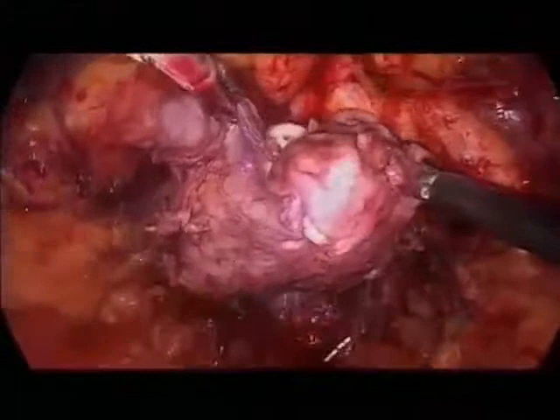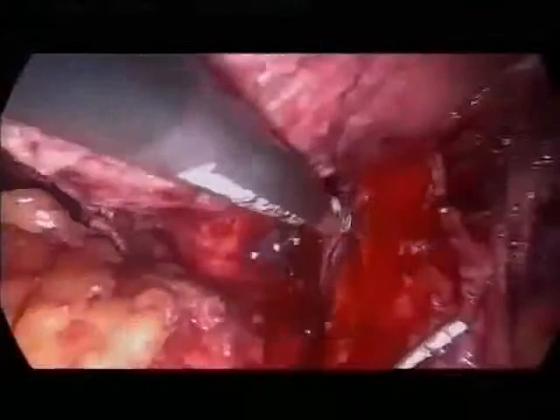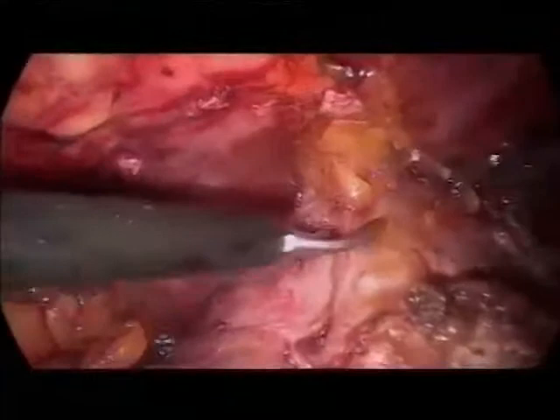Go under the prostate. You see here on both sides the so-called bundles and the rectum here. And we are very close to the apex. So, okay, go back. What we do now, we mobilize the apex a little more, and then we ligate the Santorini plexus. And with the same ligation, we will fix the bladder neck to the symphysis.